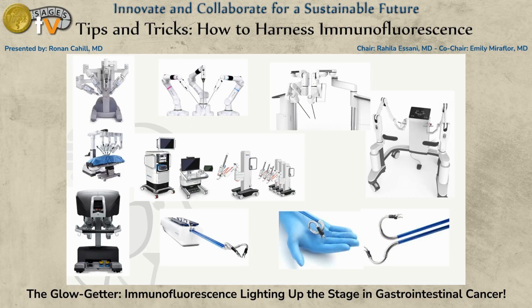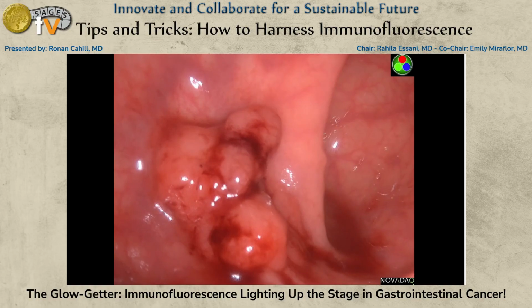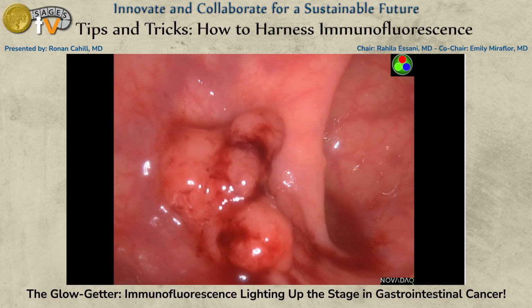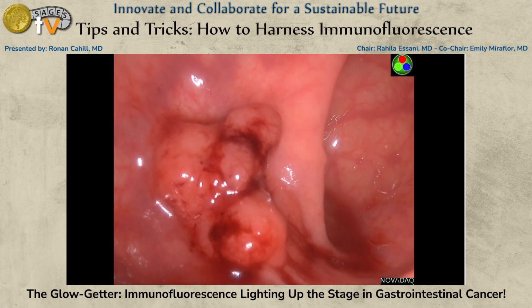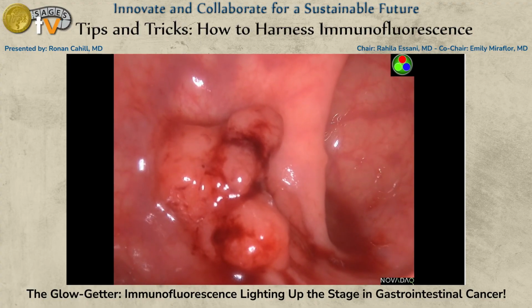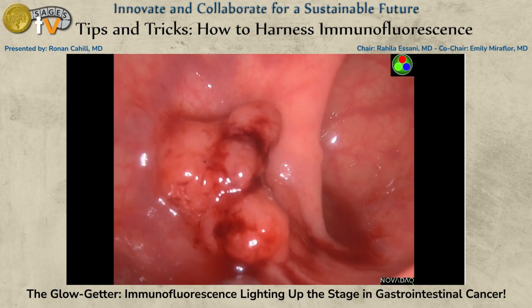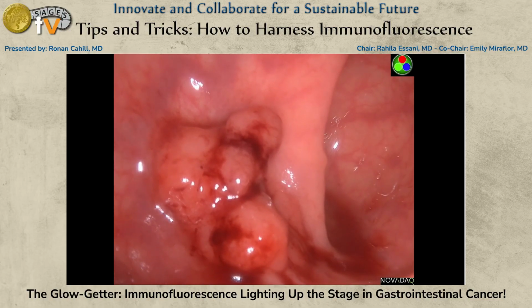The session before the trade show outside shows that we have loads of tools to do operations with, but still surgery requires decision making. And to look at this significant polyp, this is what you might encounter if you're doing colonoscopy. You may have been expecting it, you may not have been. Who here knows this is definitely a cancer? Or who here knows it's definitely not a cancer? Because that's the jeopardy. It's not so much the identification of these big lesions, it's the characterization of it.